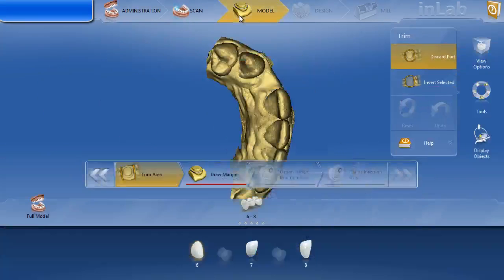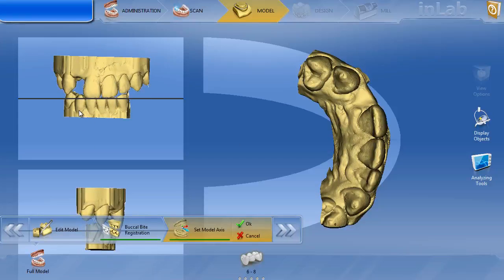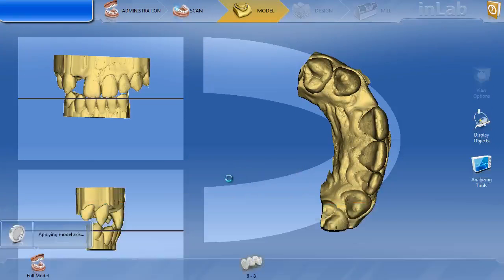Before I move forward with margination, let's go back and look at the model axis. It's set pretty well. I usually look at the left side — I like to make the midline of the central incisors perpendicular to that black line, which it's clearly not here; it's a little bit of a cant. So I'm going to rotate this model so the midline of the central incisors is perpendicular to that black line. It really didn't change a whole lot, but it sets the occlusal plane a little bit better. What we're looking at on the bottom is just the angulation or inclination of the central incisor — I might want to change that just a touch to get a nice inclination. When we're done, we hit OK and move on to margination.